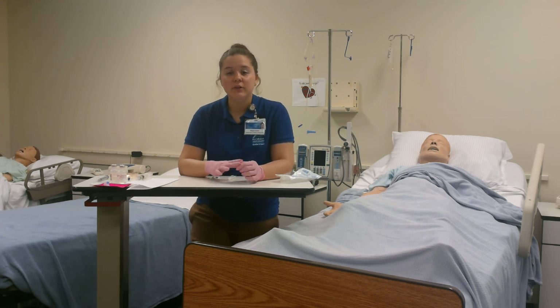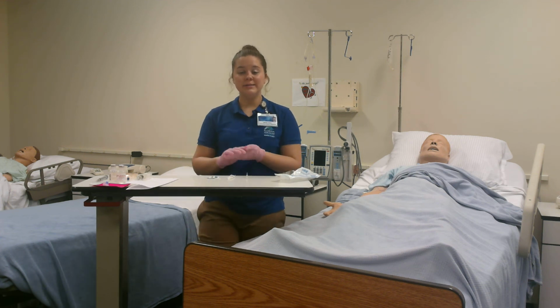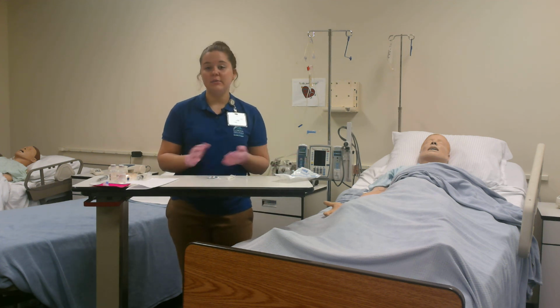Record the volume of fluid in the minibag, which was 50 milliliters. And we're going to also update our intake and output record. I'm going to dispose of my gloves, wash my hands, and the procedure is now complete.